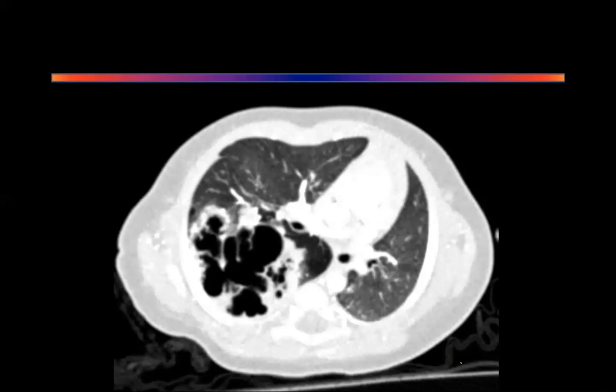So can this be cystic fibrosis? Probably not, because cystic fibrosis is more generalized. This is localized to a lobe. If you look carefully, there's a fissure here. Can you see this fissure? This lobe is completely normal. This lung is completely normal. But it is localized for some reason to this lobe. You agree with me or no? Yes, sir. So what do you think?